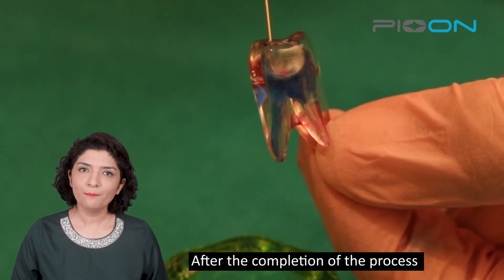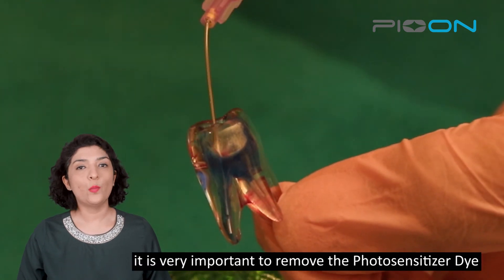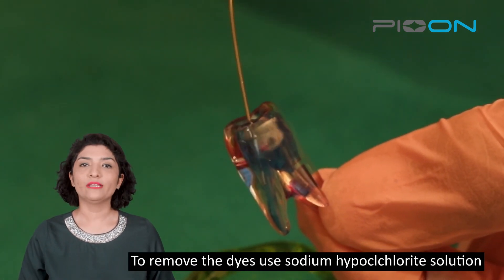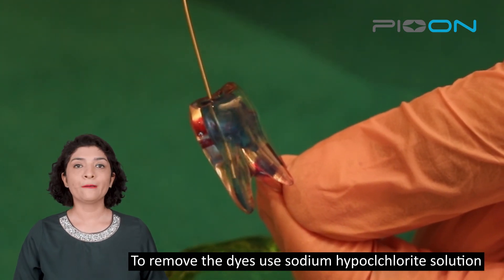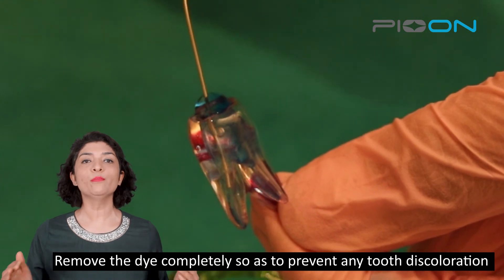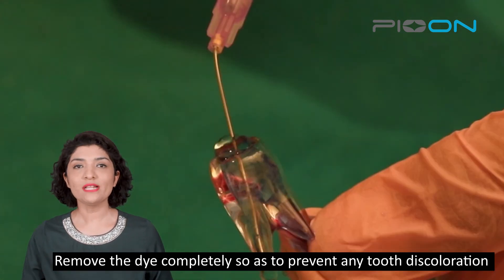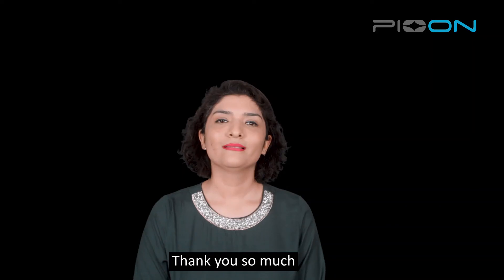After the completion of photoactivated disinfection, it is very important to remove the photosensitizer dyes. For this, you have to use sodium hypochlorite and completely remove the photoactive substances so that there are no chances of any tooth discoloration in the future.